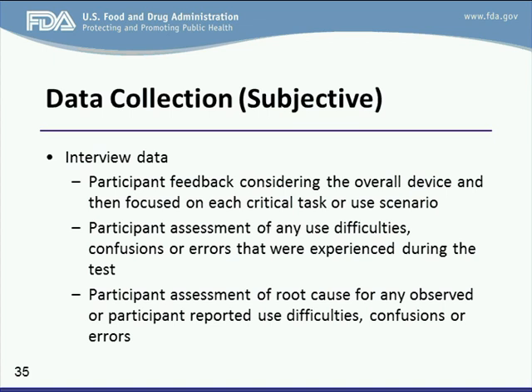So the second big category of your data collection is subjective data. And you can generally track the subjective data by the interview. So there are a few categories that you can collect by subjective questions. The first one is you should get participant feedback upon the overall device use and each use scenario.